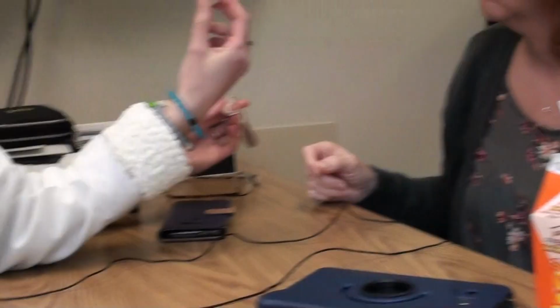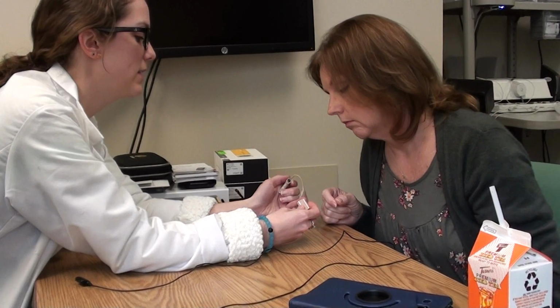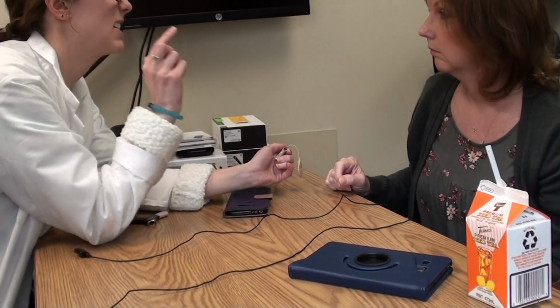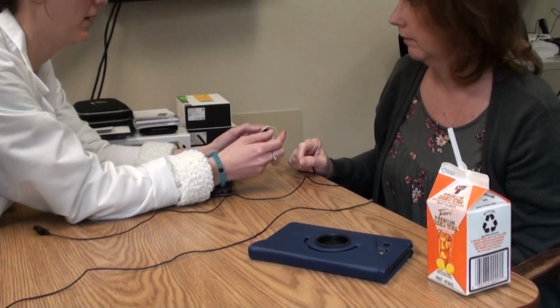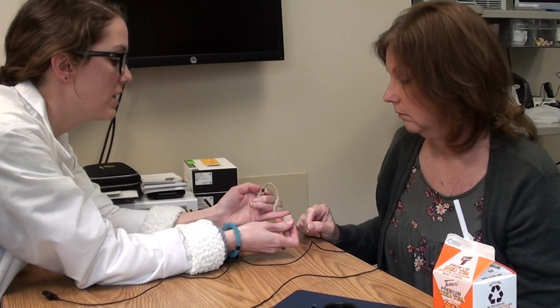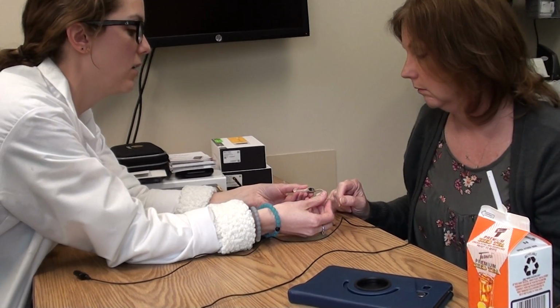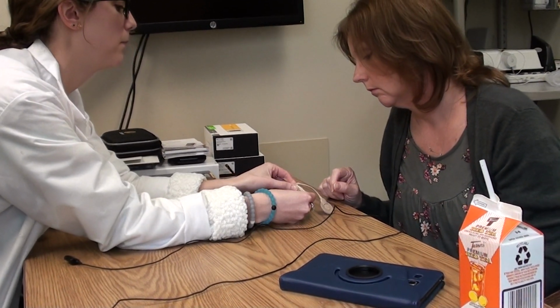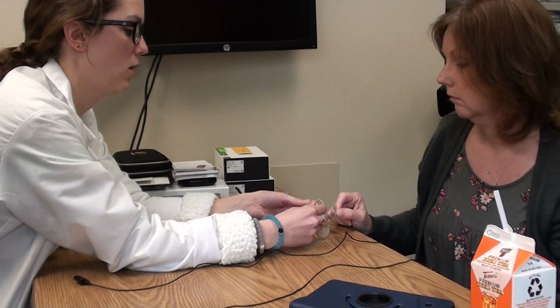Okay. So it's rechargeable. There's a little arrow that points, and that means it's the back of the battery. So it goes toward the back of the implant. These are a little catty corner. You see that? You want to line those up. Okay. And then twist. Okay?